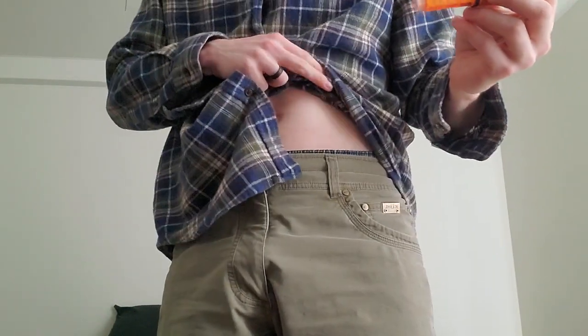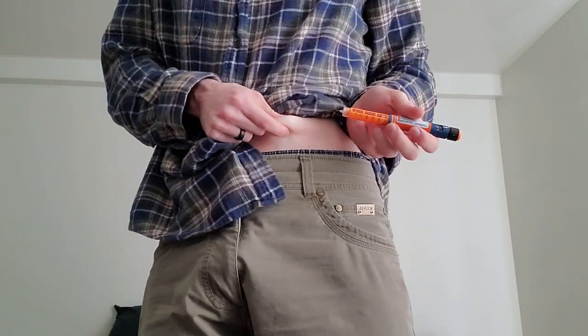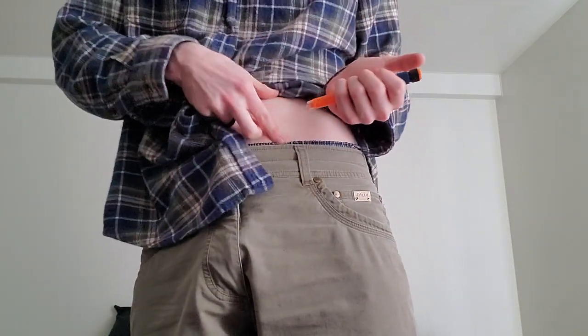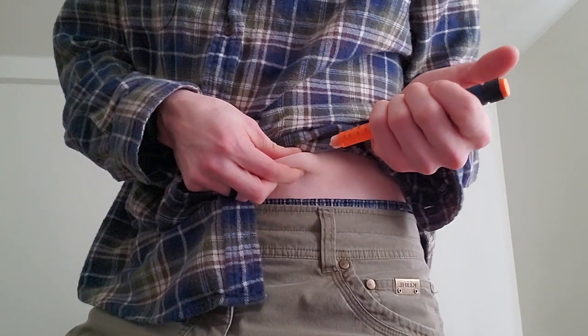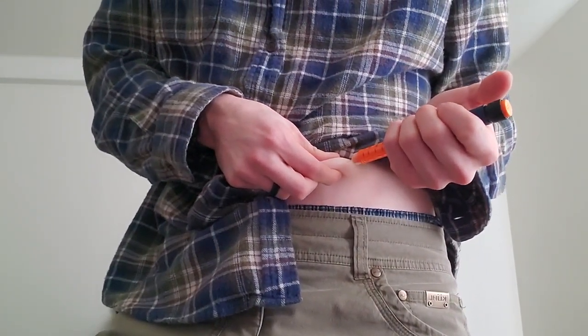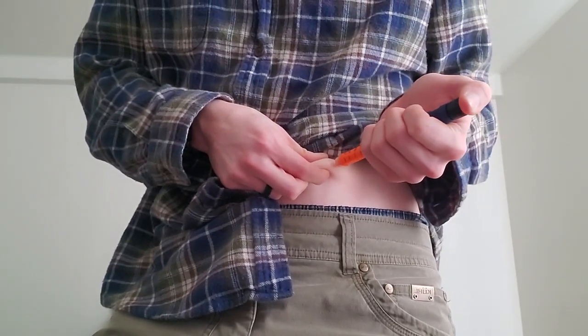So you're going to take the needle and put it into the injection point that you just wiped down. Pinch the skin to get some fat, right? Just pinch the skin. Take the needle. Aim at about a 45-degree angle is how you want to go in. So take the needle, 45-degree angle. Just put it in all the way.